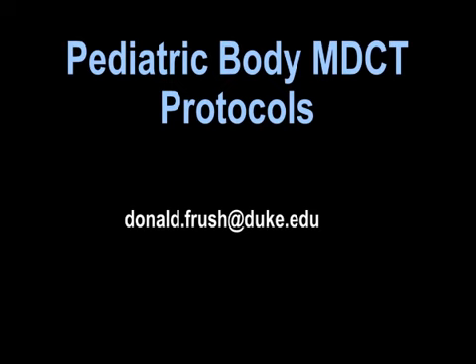I believe that the chest needs a lower kV and needs a lower mA. And if you've got an appropriate kV selection and tube current modulation set up to be able to do that, then it's helpful. But I don't think all manufacturers allow you to do that with a single noise index and so on. And they may have changed, but there are some nuances that you can't use the same thing. And like I said, too, through the chest, we use a different noise index than we do through the abdomen. And we can't really go through in one fell swoop.